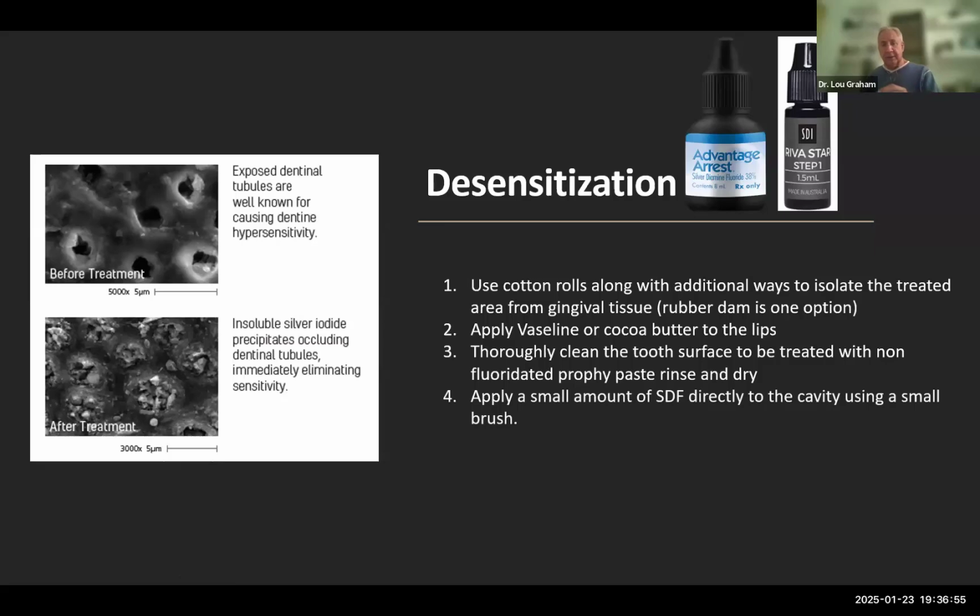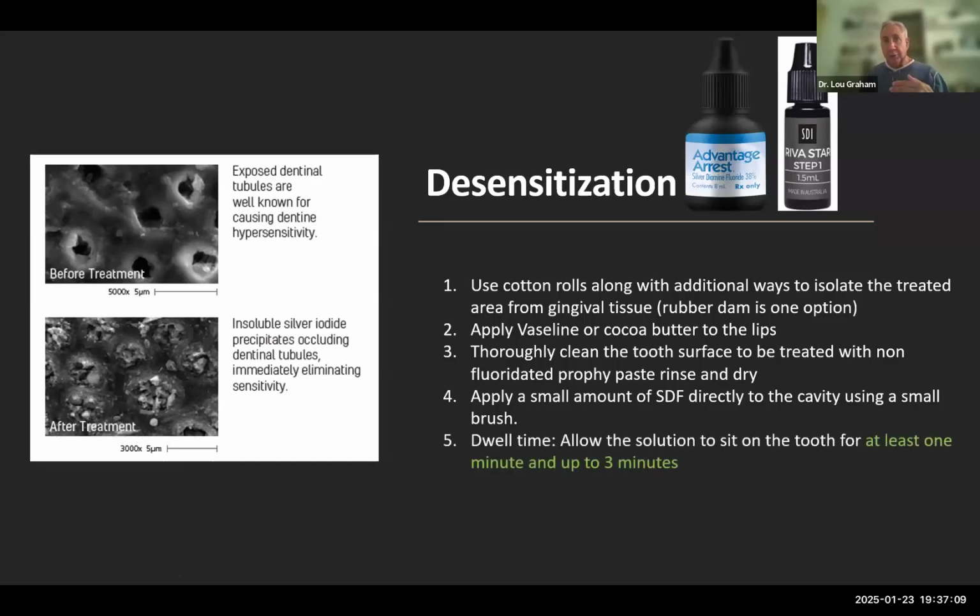After you clean the sensitive area, probably with some non-fluoridated prophy paste, the instructions are you would apply some SDF right into the area. You would allow it to saturate the area for 1 to 3 minutes. I would tell you we would really use up to 3 minutes because we would want that deeper penetration. After that 3 minutes, we would gently blot dry the area.